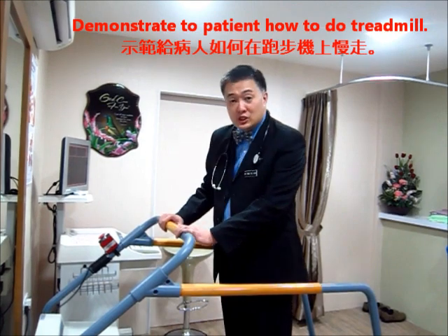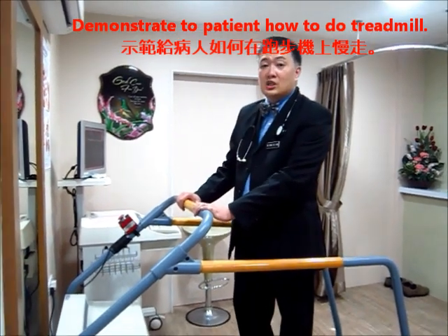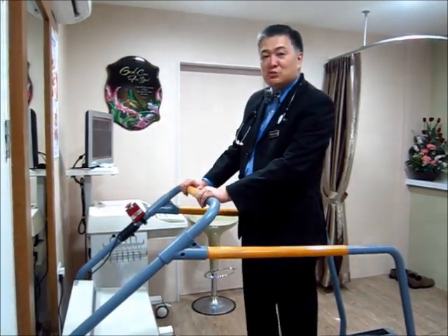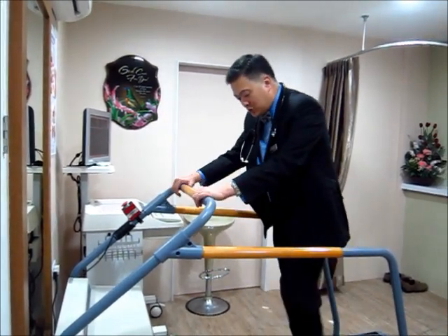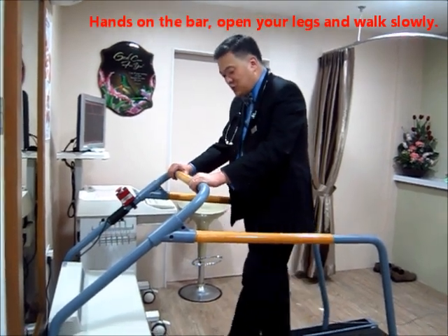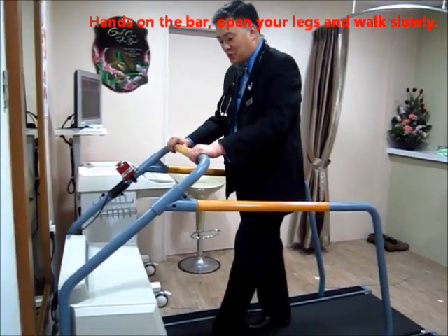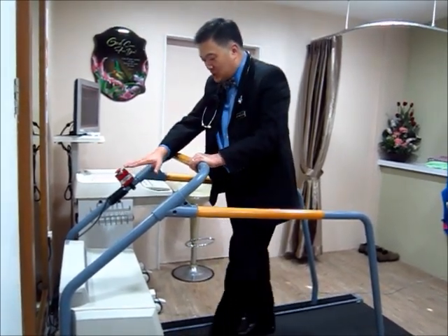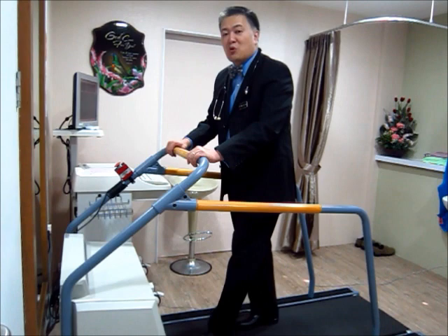Next, I will demonstrate to the patient how the treadmill works. I activate the machine and tell Mr. Koh to hold on here, slowly move on until you get to the speed. The machine will increase the speed gradually.